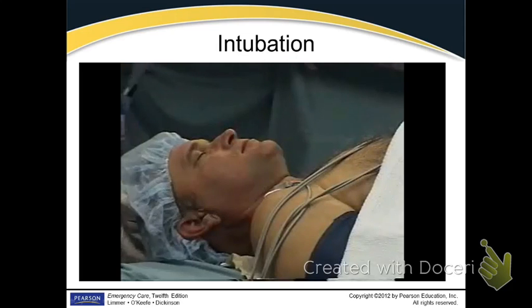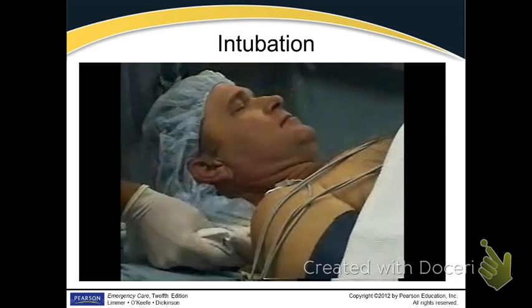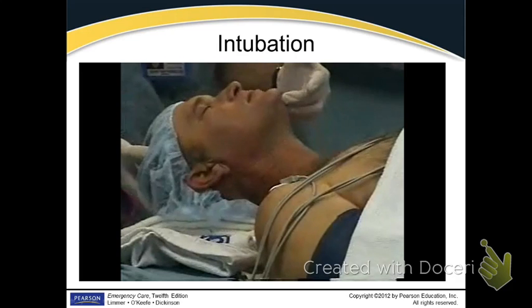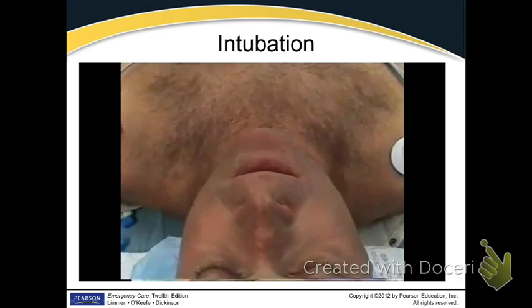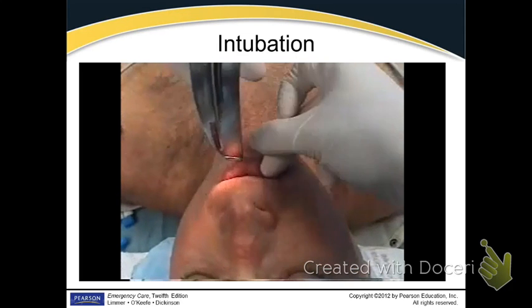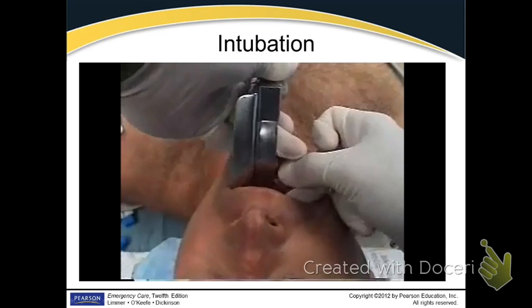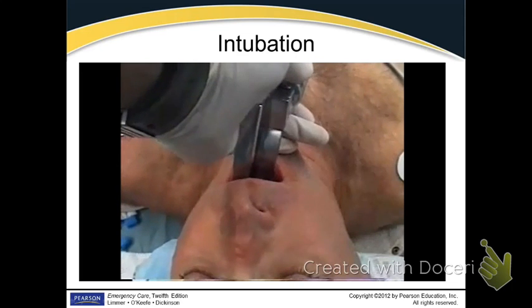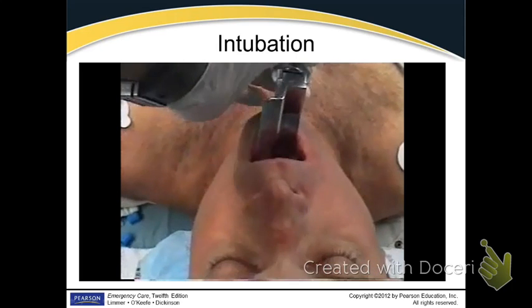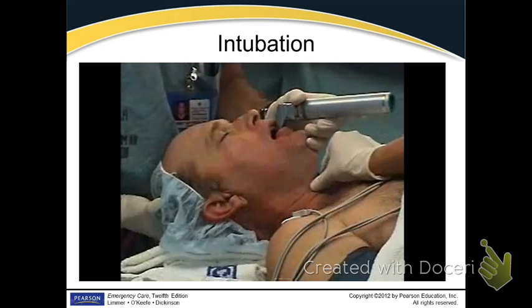Proper head position will improve visualization of the larynx. Leave the head in the neutral position if there may be a neck injury. Otherwise, elevate the patient's head on a couple of towels and extend the neck. Hold the laryngoscope with the left hand and open the mouth with the right. Gently slide the blade into the mouth, being careful not to pinch the lips or the tongue against the teeth. Insert the blade on the right side of the tongue, displacing the tongue towards the left. An assistant can retract the right side of the mouth and improve visualization. Cricoid pressure sometimes brings the larynx into better view.